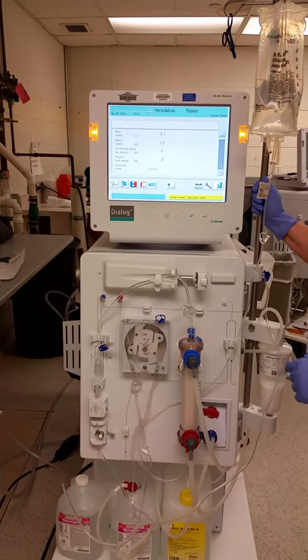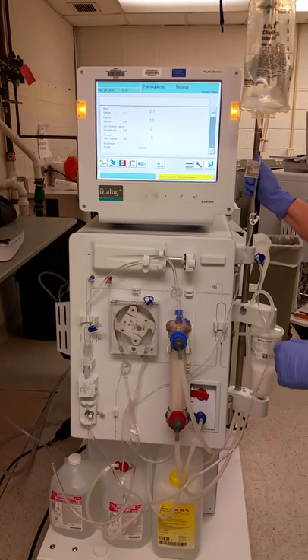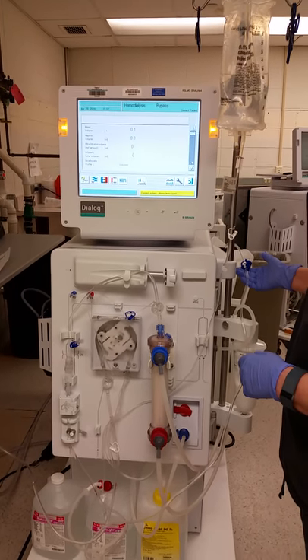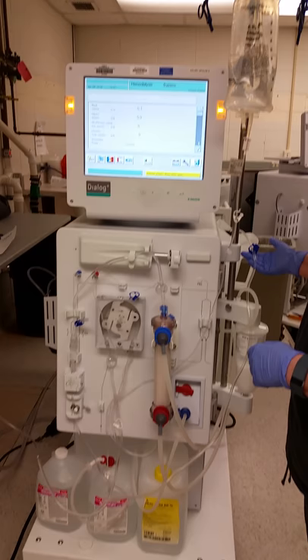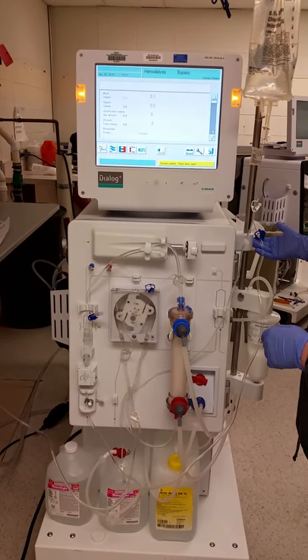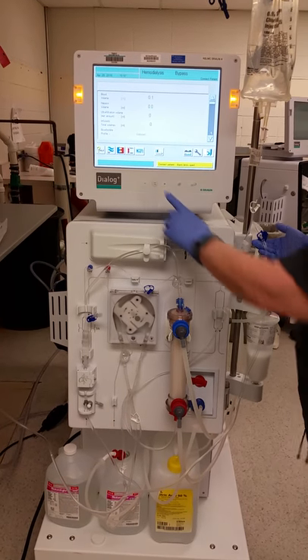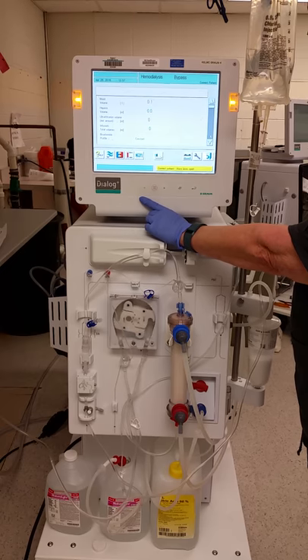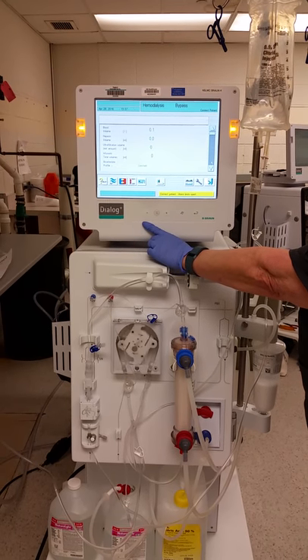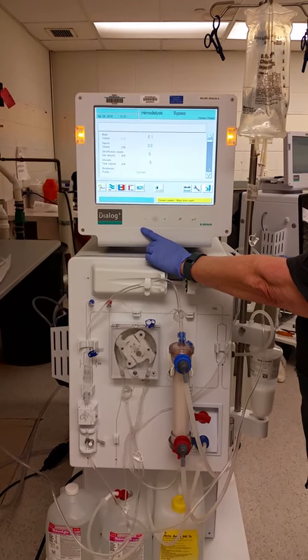It seems to take a long time between 0.1 and 0.2 — don't be concerned. Let it continue until the volume gets to 0.2.